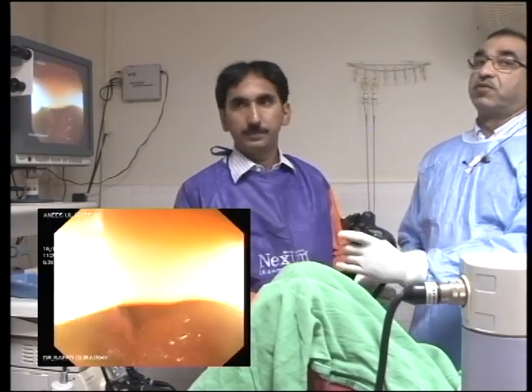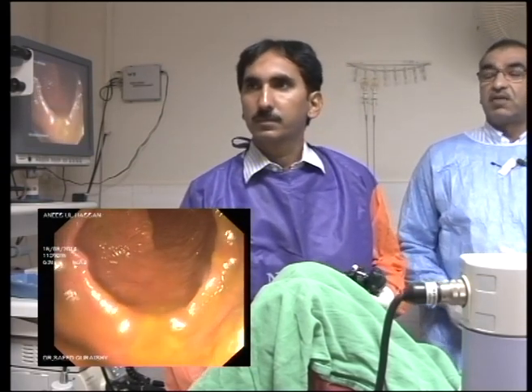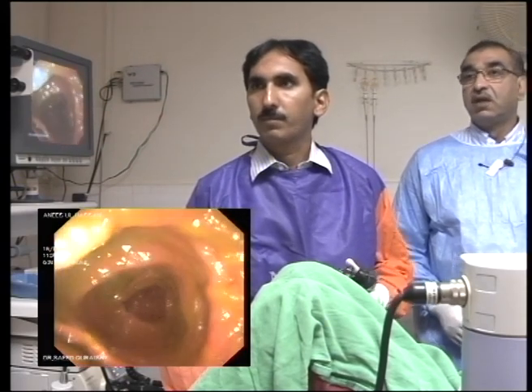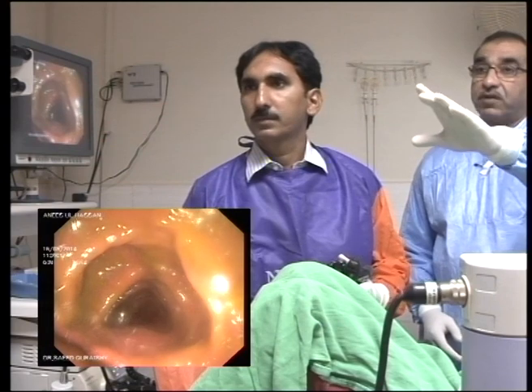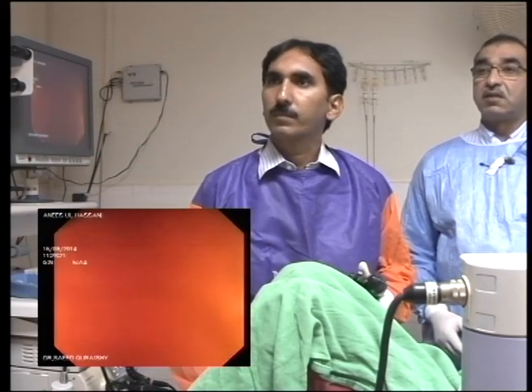Okay, go ahead and start, and try not to suck too much. Yes, let's not suck, because then your view will get spoiled. Yes, that's okay. Clear your lens. Yes, that's okay. Try to look behind the folds a little. You're coming in a bit fast. Yes, clear your lens, clear your lens.